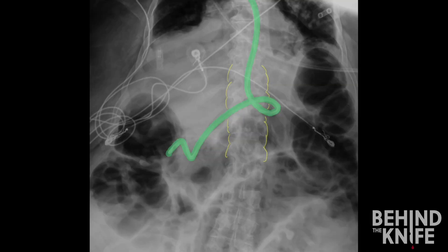Here is an example of a nasogastric tube that is post-pyloric, or placed into the duodenum. The tube is highlighted in green, and you can see it entering the left upper quadrant and then crossing over the spine into the right upper quadrant. If your nasogastric tube crosses the spine, then the tip is likely in the duodenum.